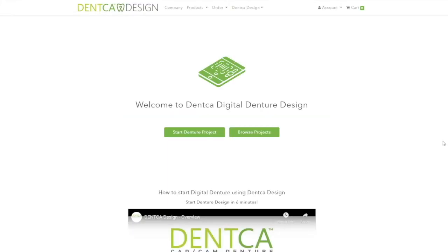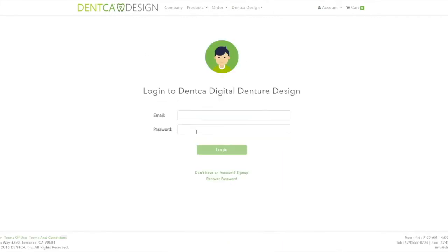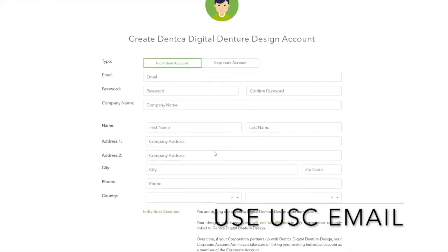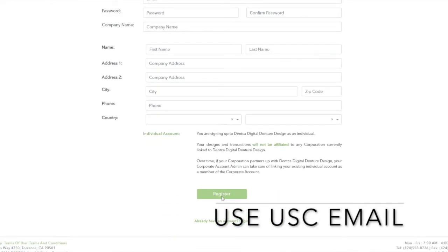The first step is to log into the Denka Design website, denkadesign.com, and click on Start Denture Project. If you haven't done so already, it will be necessary to sign up and create an account first. Once created, log in and click on the Create New Project button, where the system will ask you to upload your scanned files.